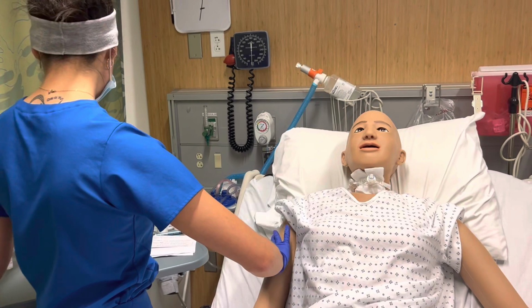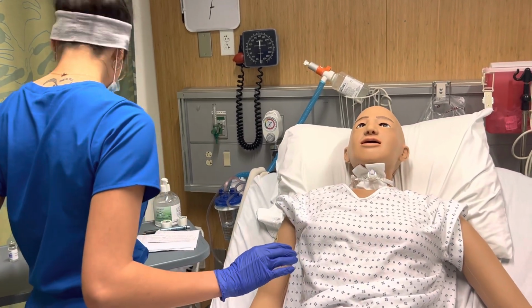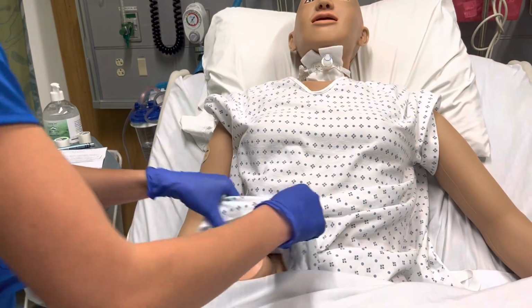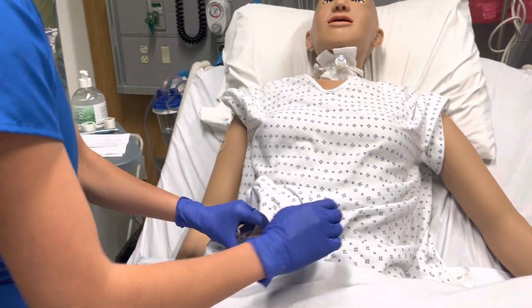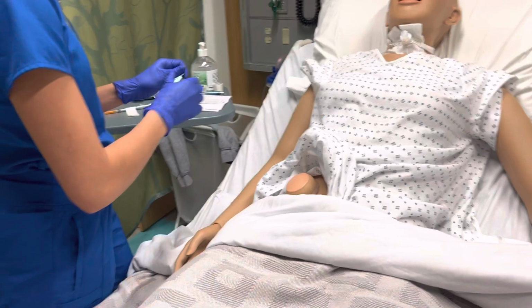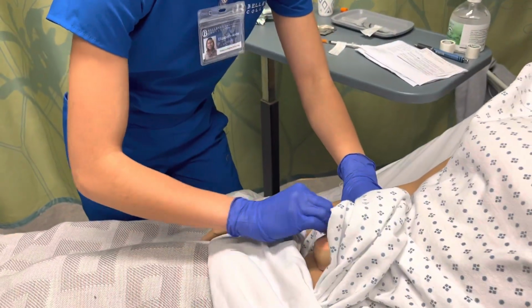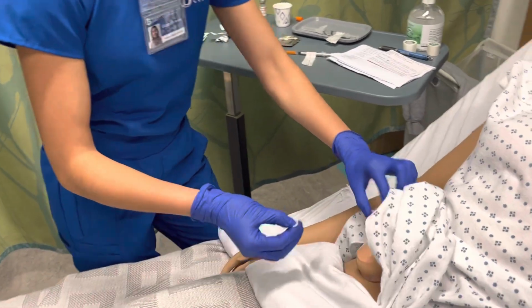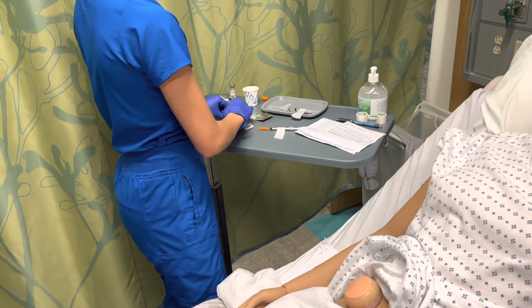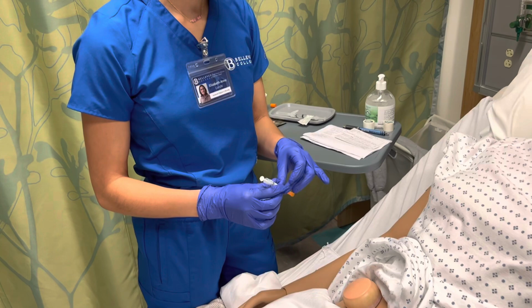Okay, next we're going to administer your insulin. So we're going to do this here in your abdomen. And you got it in this site first or last time, so we're going to do it over here. I'm going to clean the injection site and allow that to dry completely before administering our insulin.